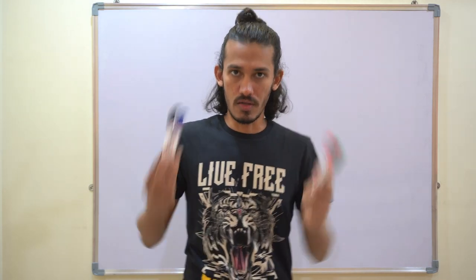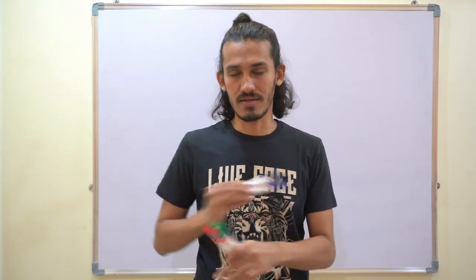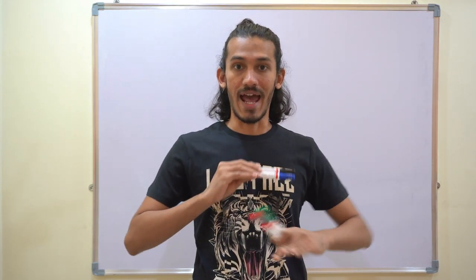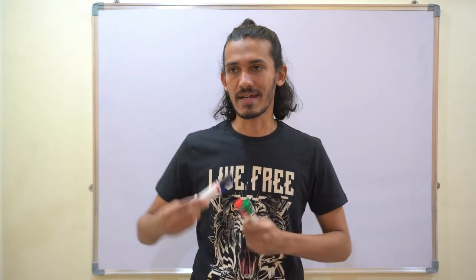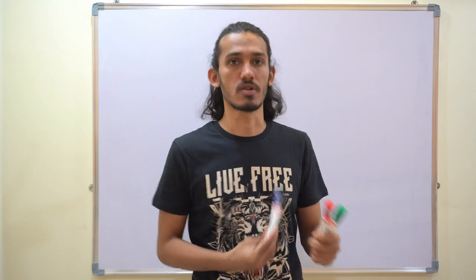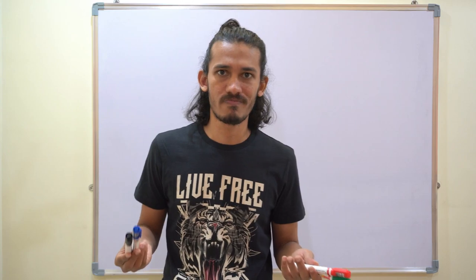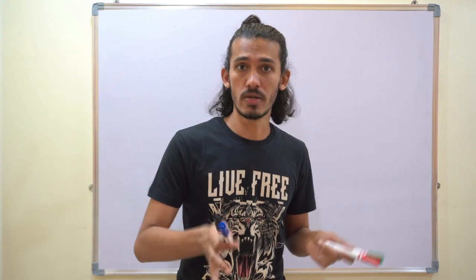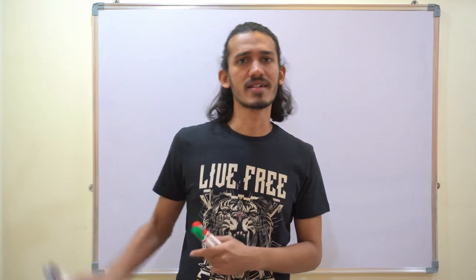Although we say it is unipolar, you have to understand that it's not completely unipolar, because it's very difficult to create an absolute zero potential. Some amount of potential will be there, so you can't exactly call it unipolar per se unless you create a zero potential. But for experimental purposes, this will do. Now that you understand what a unipolar lead and a bipolar lead are, we'll take a look at how it was done historically.